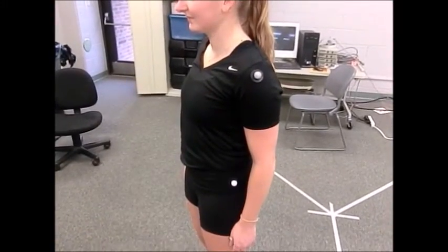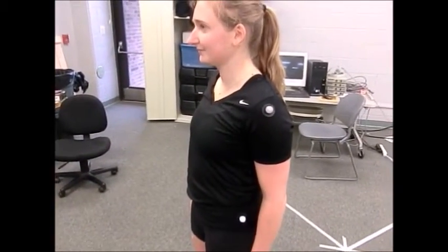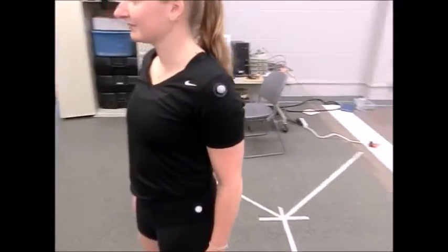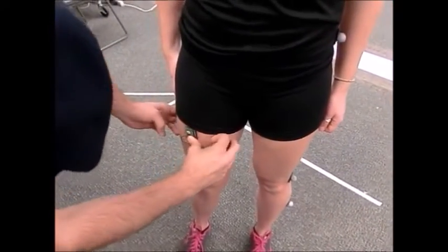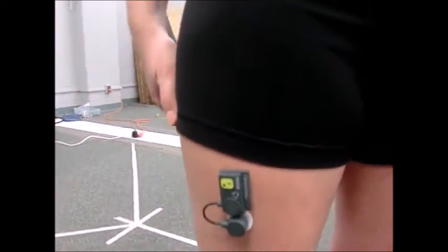Alrighty, so in the SpeedMaker study we used these reflective markers here to check knee and hip angles, and other than that we also did electromyography where we used these clips here. And we clip them on there, and that picks up the electrical activity in the muscle.